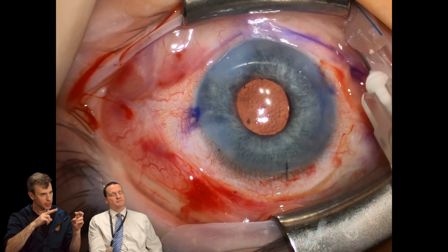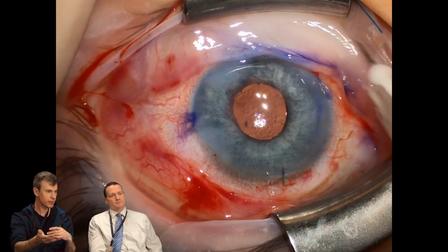Sometimes you'll hear about the Yamane technique. We can link a video to that where the haptics are externalized. But the problem is if you have a large eye, the haptics might be too short and they're not made for that length, so under stress, and you can't place it as far behind the iris. Here I can go however far back I want because I have inches of suture that will support the lens no matter where it is. You saw how long that suture was. I mean, it could pass several times across the eye.